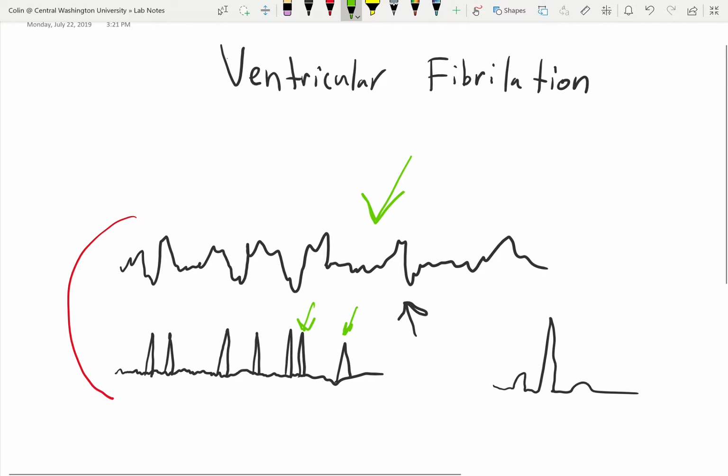So once the medics get there, if you take the AED away and you attach them to the LIFEPAK and put the pads on, then what you'd be looking for, and you can do this while you're doing CPR as an EMT, you can look over at the box, and if what you see when you stop CPR is all this scribbly, crazy nonsense, then that's VFib. And I'd say that's pretty easy to recognize.